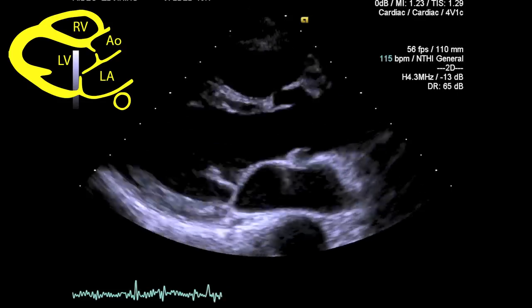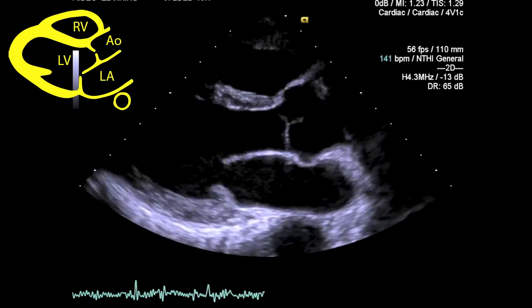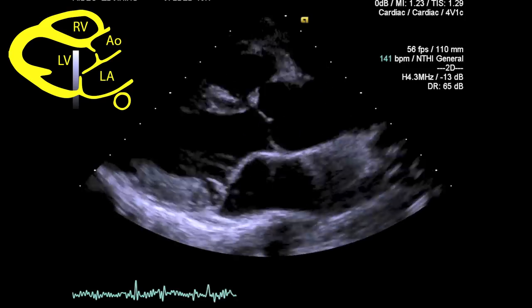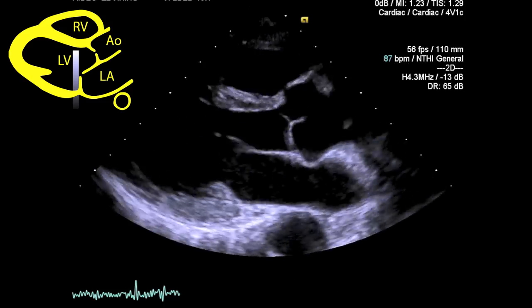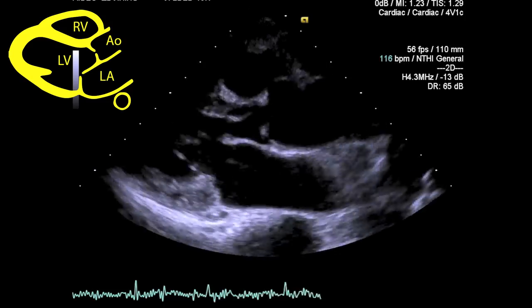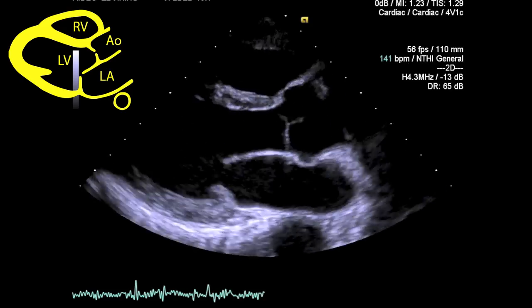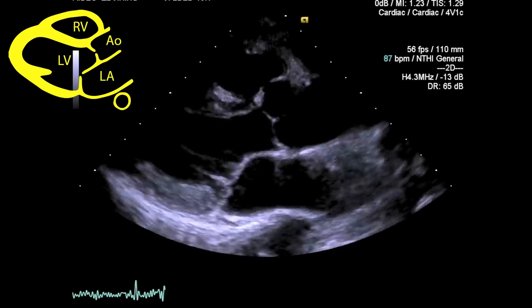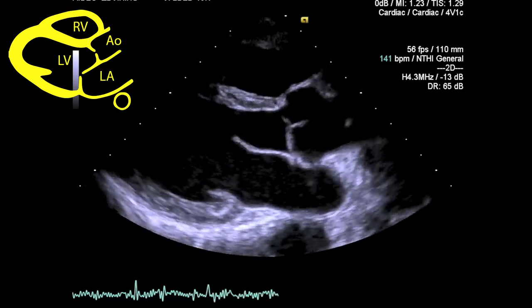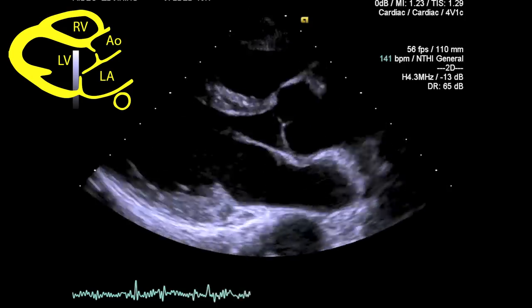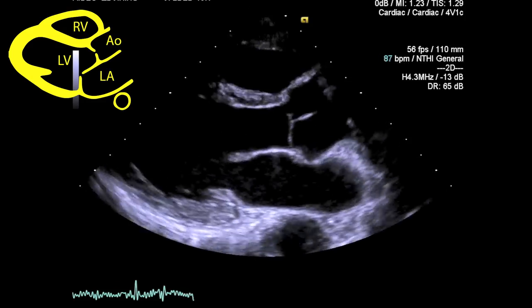Once you obtain an image, optimize it with not only your knobology but also small movements of the probe, which may require a bit of angling, tilting, and rotating to ensure that the aortic valve and mitral valve are on view, as well as the left ventricle in the long axis with the cavity open to show the widest possible distance. You should not see the apex of the heart.